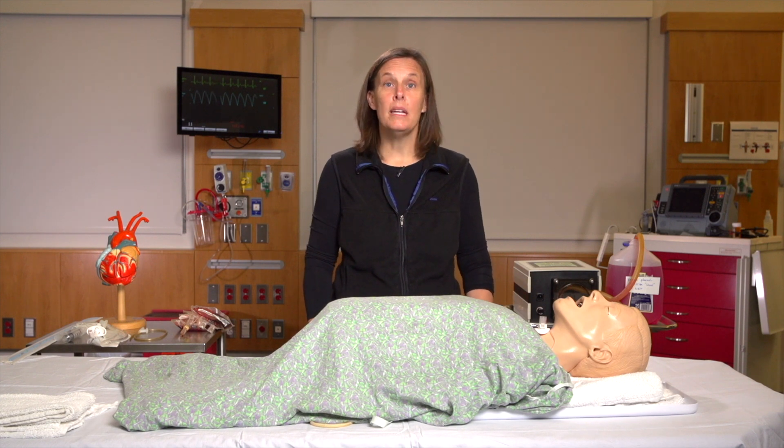Welcome to our simulation center at the University of Mississippi Medical Center. My name is Emily Tarver and I'm an assistant professor of emergency medicine here at UMMC. Today we're going to talk about some modifications that we made to Arthur, our mannequin, in order to simulate bleeding from a tracheostomy tube secondary to a tracheoanominate artery fistula.